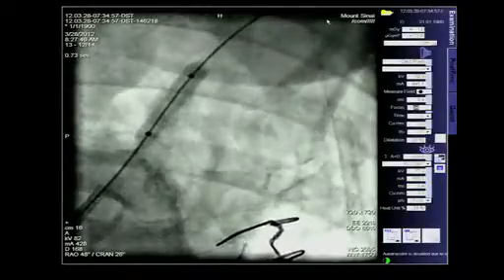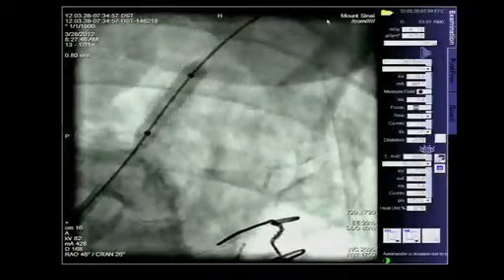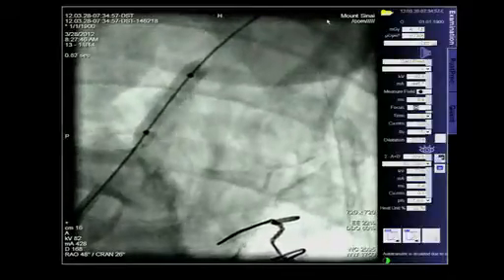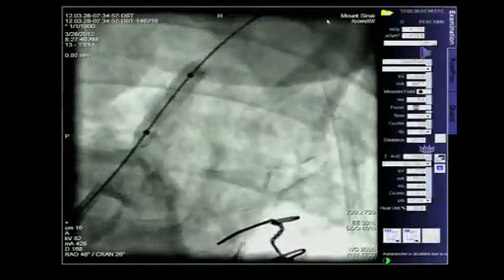The other advantage of the balloon expandable stent that's been talked about numerous times is the ability to be as precise as we can be. So what do you think, Dr. Wiley? Well, if you look at the proximal portion of the subclavian, I think it is perhaps 8mm, and right at the level of the vertebral is probably 8 as well.